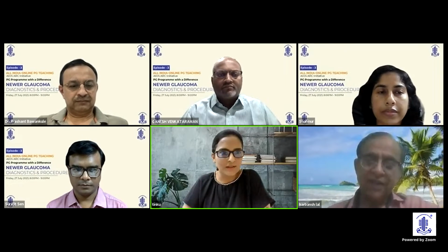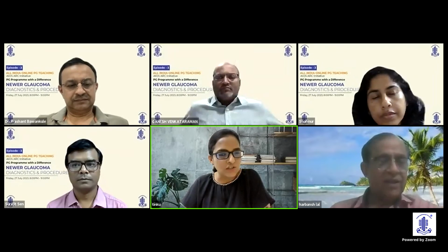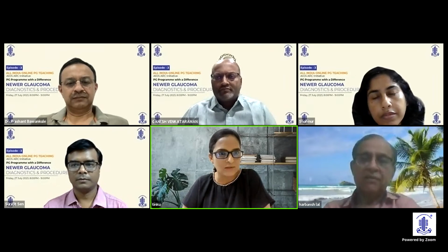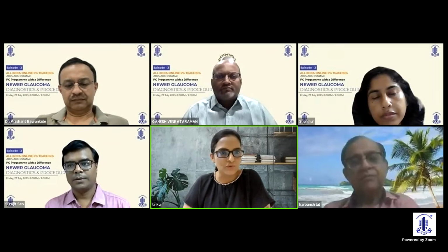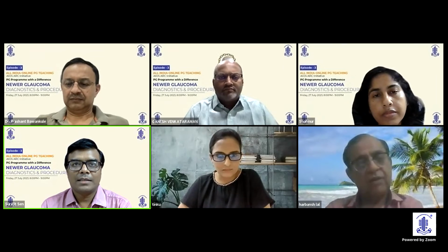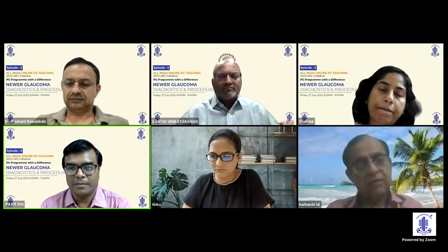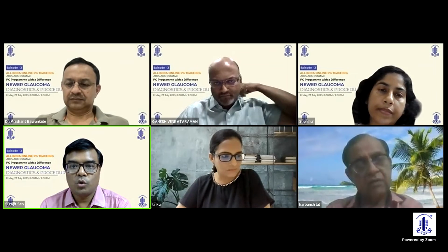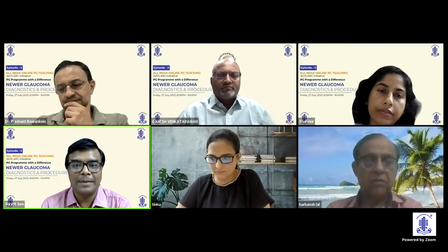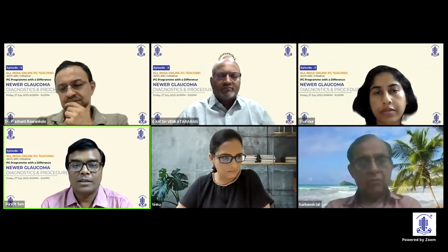A question for Dr. Surajit. Would the OCTA, that is the OCT angiography, in any way give us information about glaucoma progression in the future? Are there any programs in the OCTA which we could look at? If not now, maybe in the future. Maybe in the future it may be possible, but right now, for the diagnosis of glaucoma, the OCTA doesn't give us much information, because whatever damage has been done, we don't know whether it is because of the vessel loss, or the damage is happening first and these vessels are lost because of that. So there is some confusion about that.